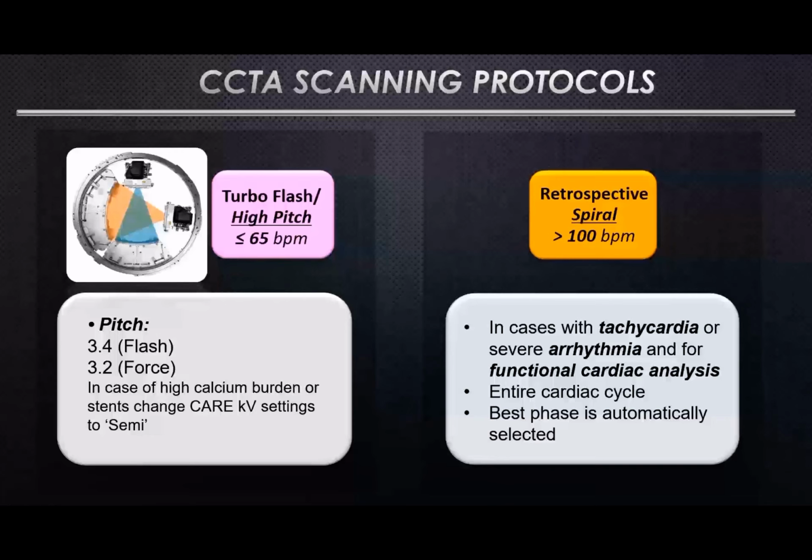However, in case of a high calcium burden or also stents, you may change the CARE kV settings to semi. That means it would not always choose the lower kV, or also you can switch it off and give a bit more kV in case that you really want to be on the safe side and don't want to run into blooming artifacts.